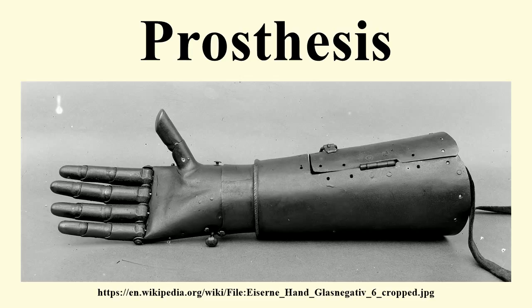Douglas Bly created a prosthetic with a suction socket, polycentric knee, and multi-articulated foot. Marcel de Sutter and Charles de Sutter, first aluminium prosthesis. Henry Heather Bigg and his son Henry Robert Heather Bigg won the Queen's command to provide surgical appliances to wounded soldiers after the Crimean War. They developed arms that allowed a double-arm amputee to crochet, and a hand that felt natural to others based on ivory, felt, and leather.